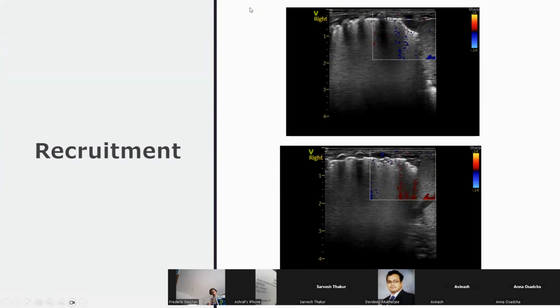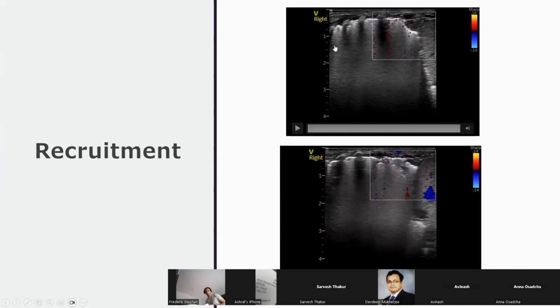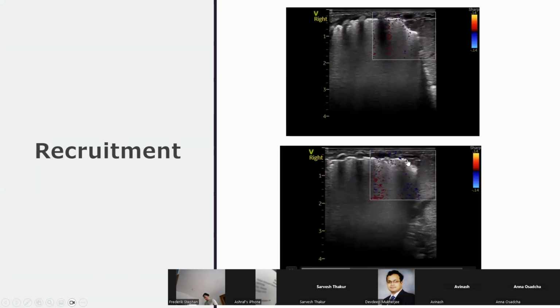Now, a simple example that I'm going to give you is this baby where we did a lung recruitment maneuver. Now, really, what we've done is we've increased the PEEP by 1 to 2 with very marginal recruitment of the lung, but without actually any change in the lung profile. And really, the challenge that I faced in this baby, an extremely preterm baby with significant RDS, who has basically an AIS pattern with an area of atelectasis. Really, that's a very small area of lung to be recruited.